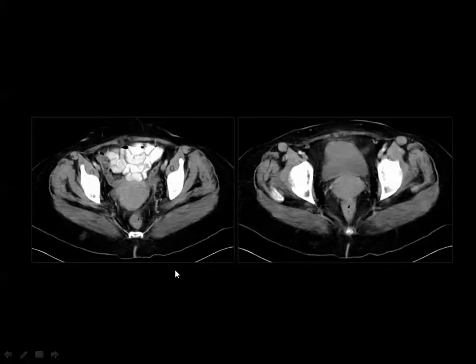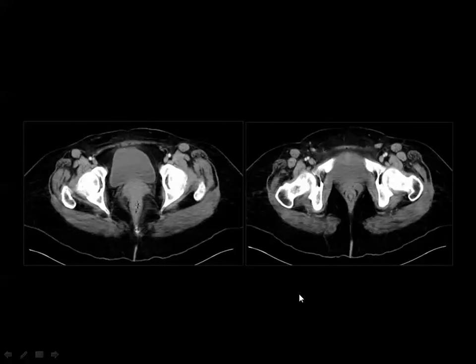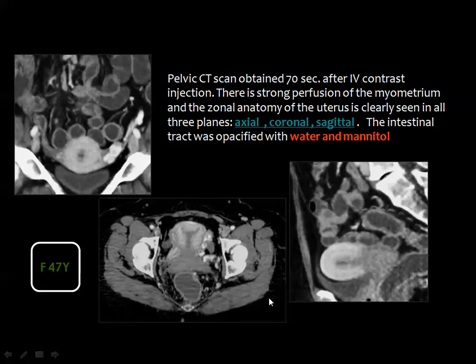Lower down you reach the region of the anal canal and the ischioanal fossa. Here you see the uterine corpus, then the urinary bladder, and the uterine cervix located between the bladder and the rectum. The final image shows the distal cervix, vaginal vault, anal canal, urinary bladder, and the ischioanal fossa filled by fat on both sides.